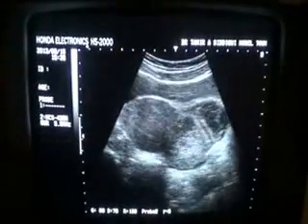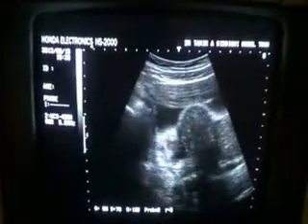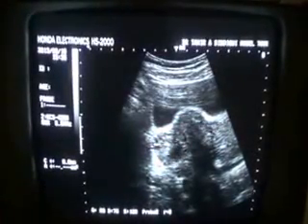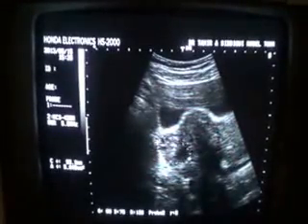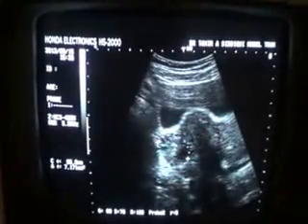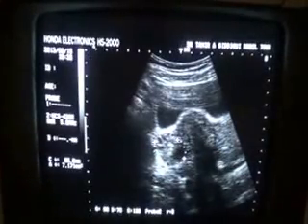So if she gets rid of this tube, the left tube, the right ovary being normal and with normal follicular activity, she can be fertile. Otherwise, there is a potential that this infection may travel to this site as well.